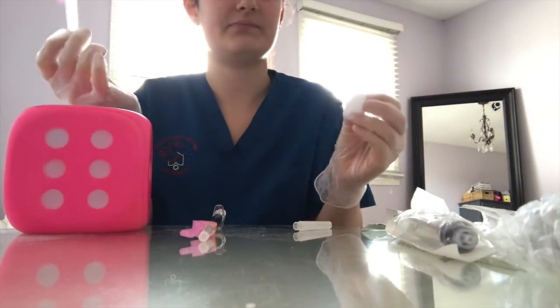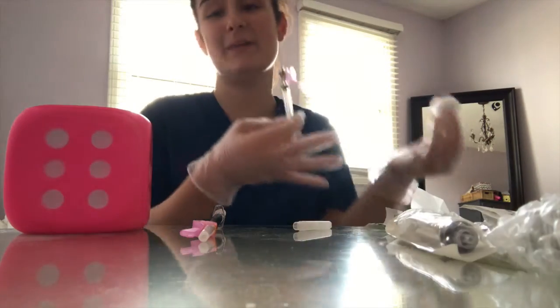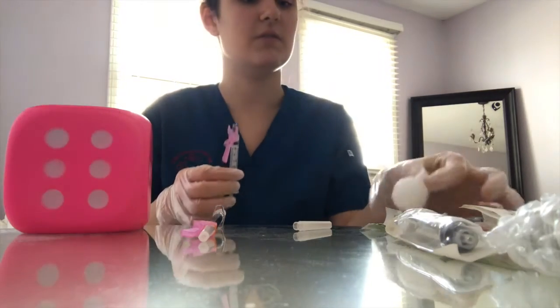Okay, there's that. So dispose of everything like you're supposed to. So into the right receptacles, right bins, okay? Put this into the sharp bin. Put this into maybe biohazardous waste, potentially just the garbage. If it has blood, make a clinical judgment, okay? Just use your mind.